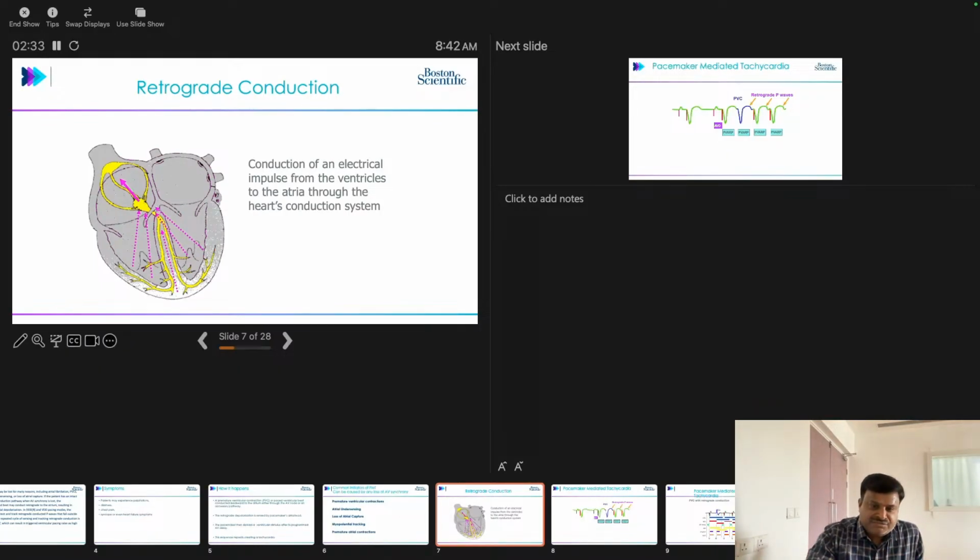The conduction will travel back towards the atrium. If you look here, I think you will be able to understand.